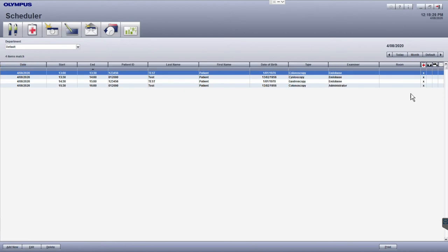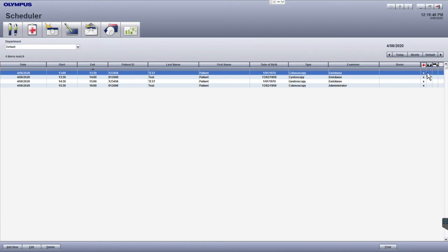The icons in the column header in the far right are the examination status indicators. You will see an X or a number in the column if that step has been completed for this examination. The examination icon tells you if the examination has been created for this patient.